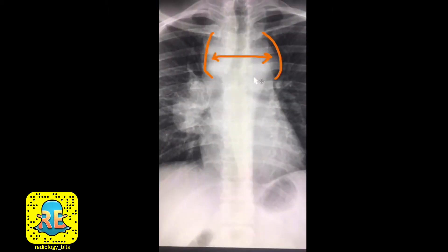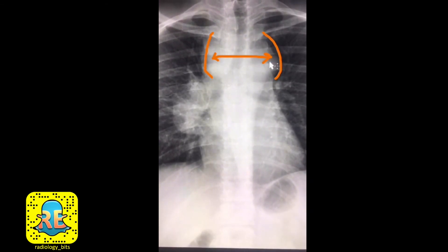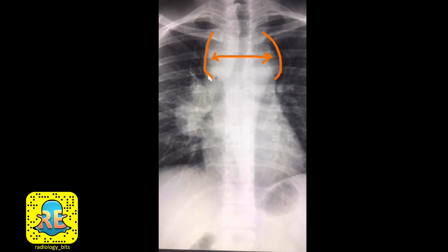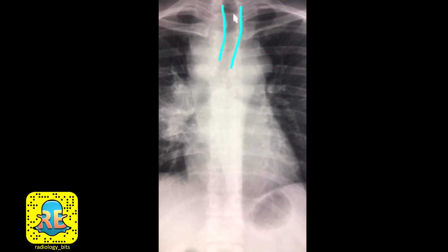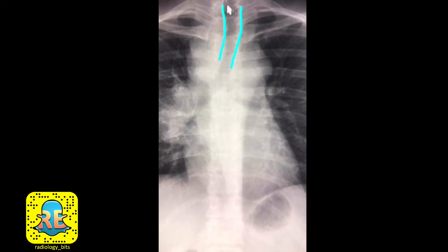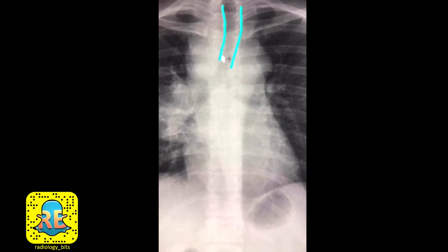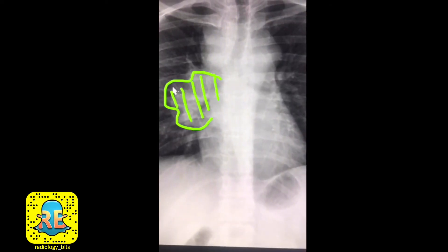Now let's look at the abnormal case. This young male patient has multiple abnormalities. The first is obvious in the mediastinum — it is widened, with both left and right borders bulging. The tracheal dark air column, which should be central, shows a minimal impression on the right side and minimal deviation to the left, indicating this abnormality is compressing the trachea.